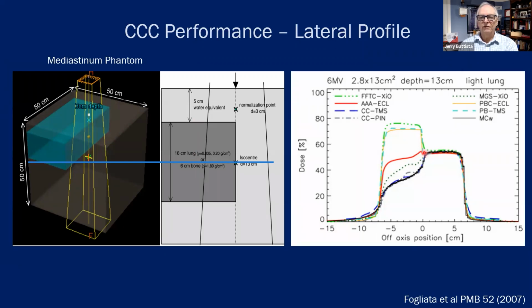The fluence of the photons is higher. You just expect an increase in dose, and that is incorrect. The real result is this lower dose here in this lung because of electron disequilibrium, and the collapsed cone method does account for that quite nicely with these very difficult test phantoms. If you ever want to check your computer system, this is a tough one to pass.